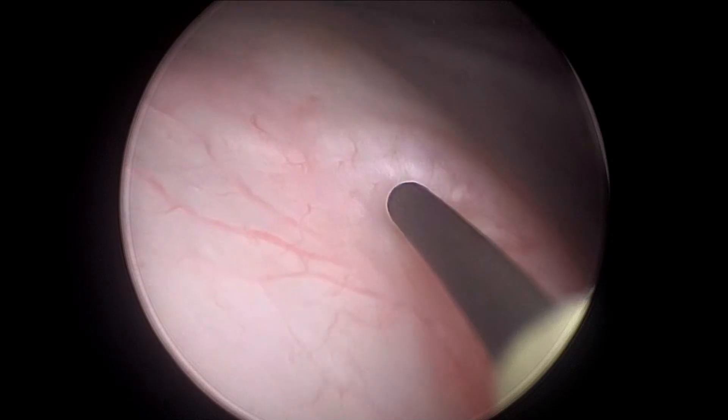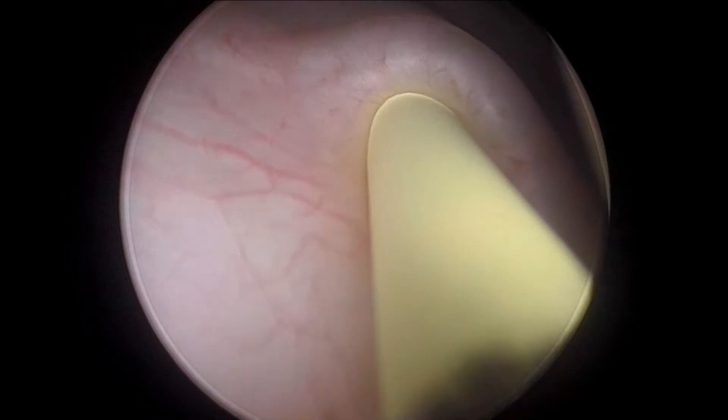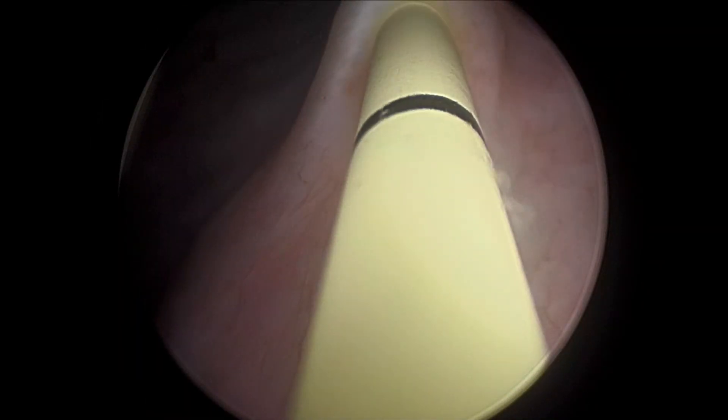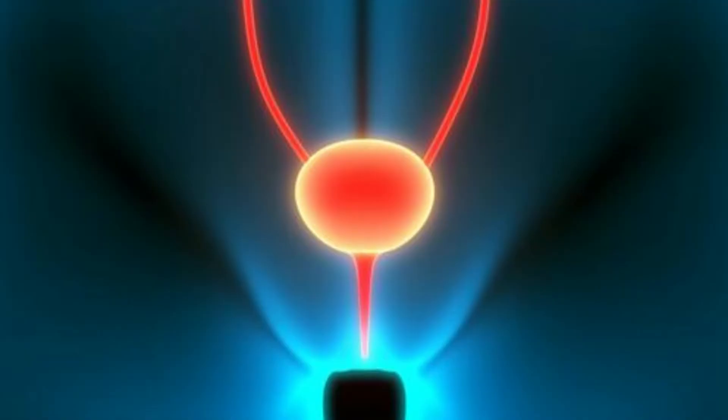Then you will introduce the cystoscope again for the left ureteric orifice. It will be introduced with the one centimeter guide wire out, and you should not keep the cystoscope too far away when pushing the ureteric catheter otherwise it will bend. You should carefully count those markings, and once done, this side is also performed.